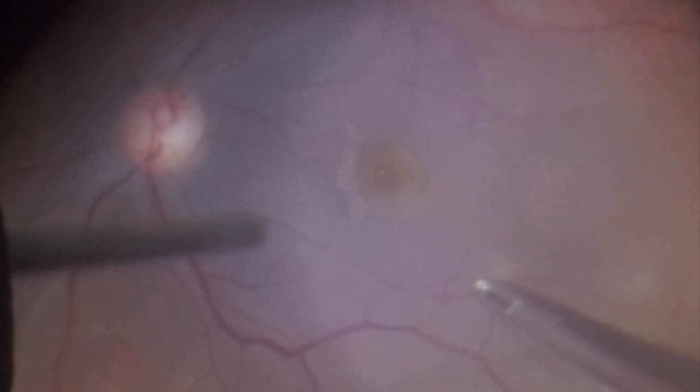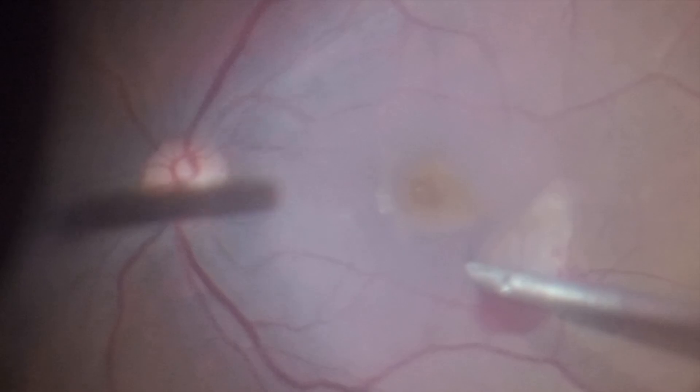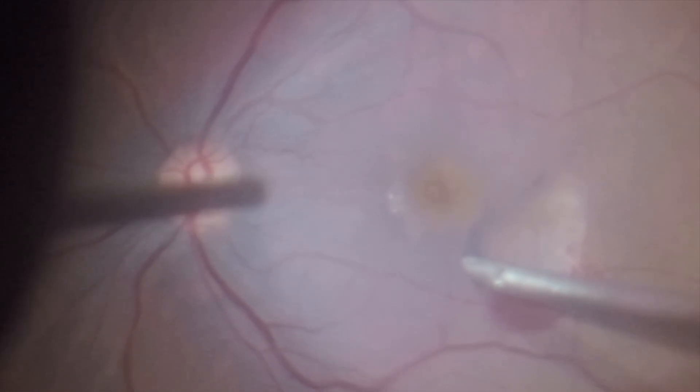The ILM peeling is initiated on the temporal side. The surgeon creates a flap at this location and then changes the direction of the peeling so that the temporal side folds over the nasal side. He then enlarges the peeled area by carefully outlining the edge of the macular hole and the inverted flap area.